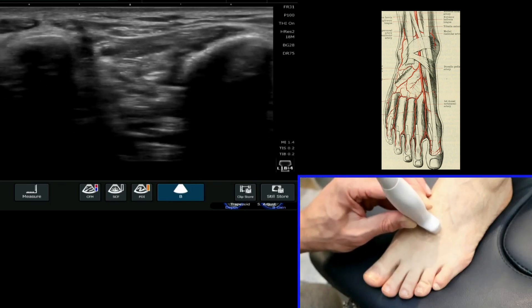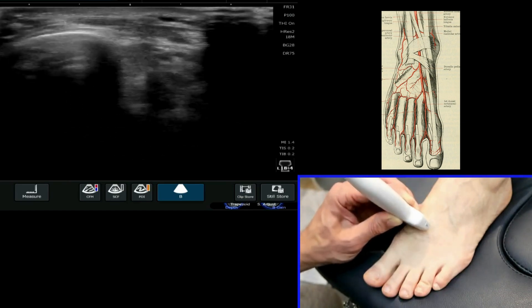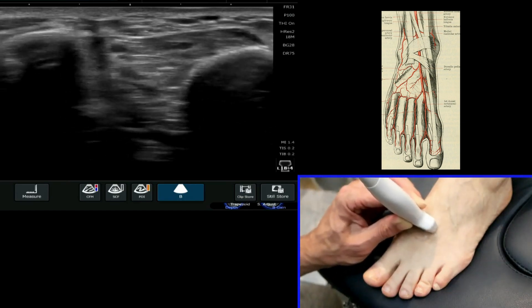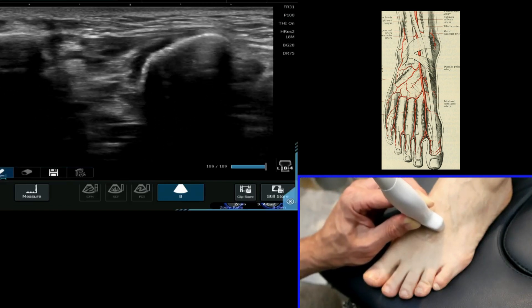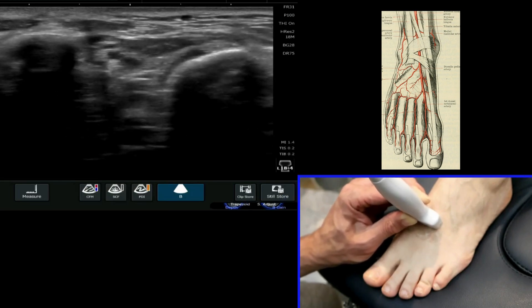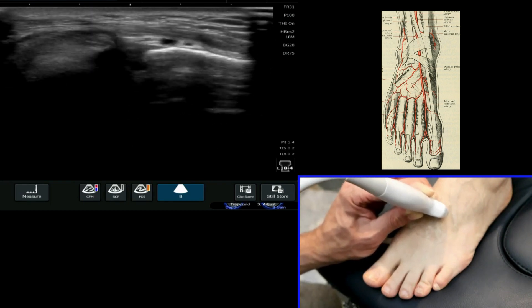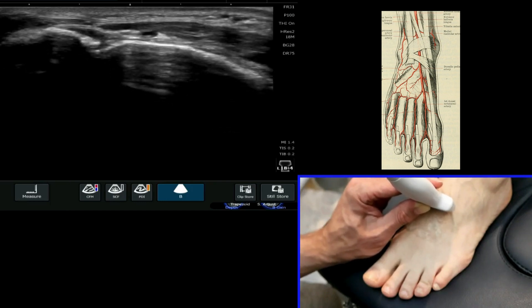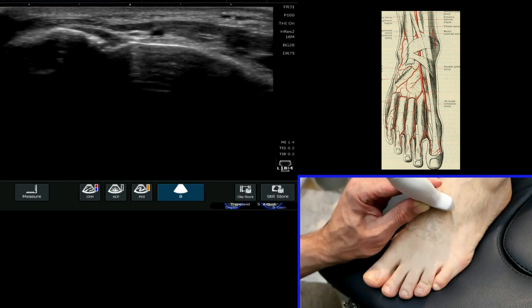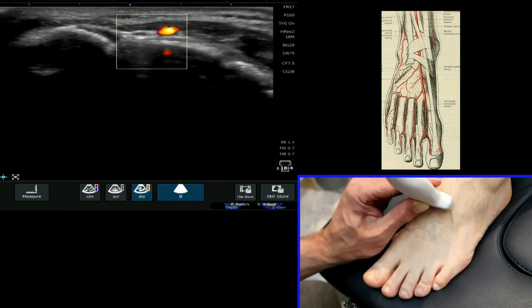If you start off by putting your probe on the dorsal aspect of the foot and find on the left of the screen the first metatarsal shaft, you then know that the next metatarsal shaft visible is the second. Within the gap between, you're looking for an arterial structure that will track more proximally, usually towards the second. You can see it quite clearly there — it's a pulsatile structure just sitting on top of the second at that point.